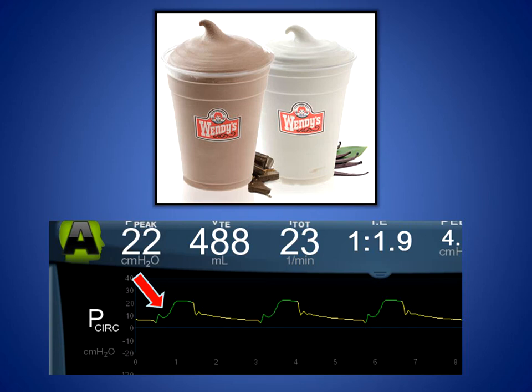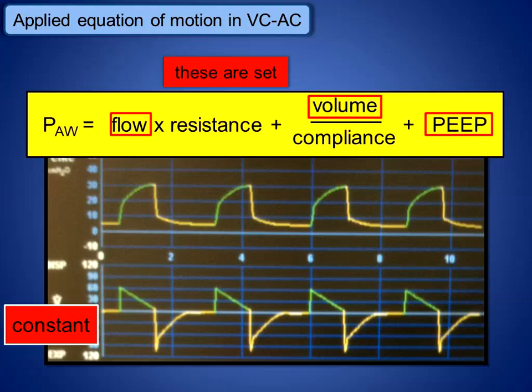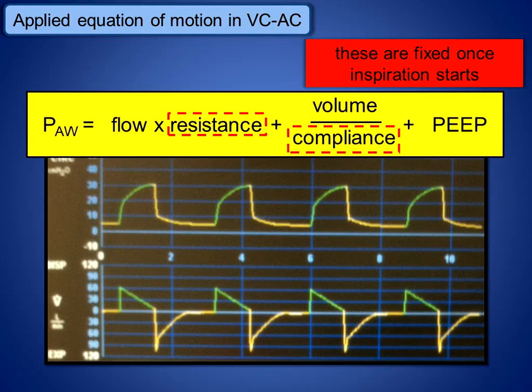So this patient, that's your analogy, is that inadequate flow is like trying to drink a really thick milkshake through a straw. I'm going to apply the equation of motion here. Analogies are really good because those are kind of what sticks with you. So this patient is sucking Frosties, trying to drink milkshakes. They're not getting it. However, the science or the physics behind it is interpreted through the equation of motion, essentially.